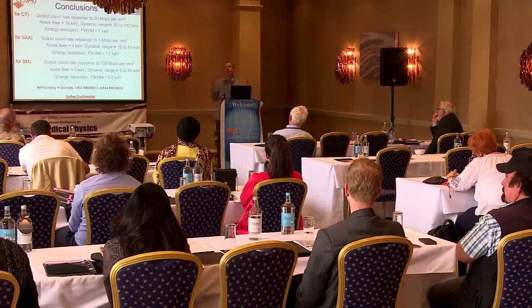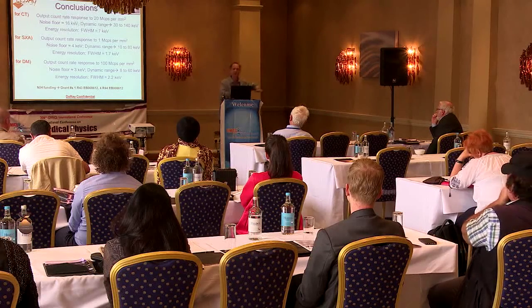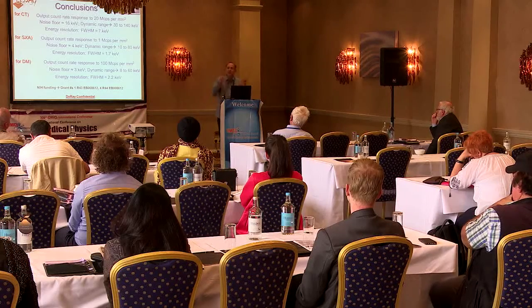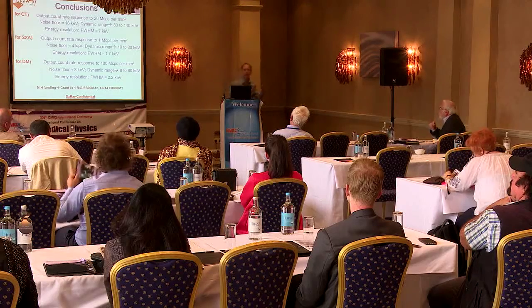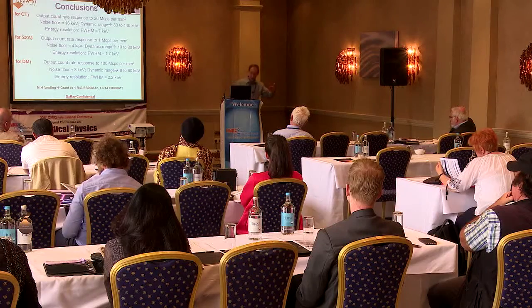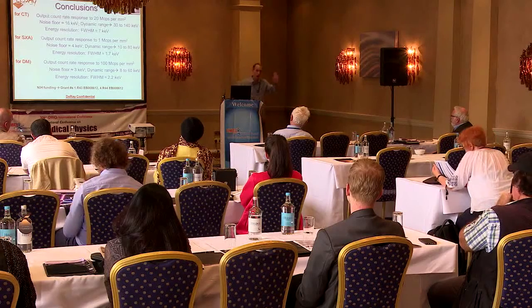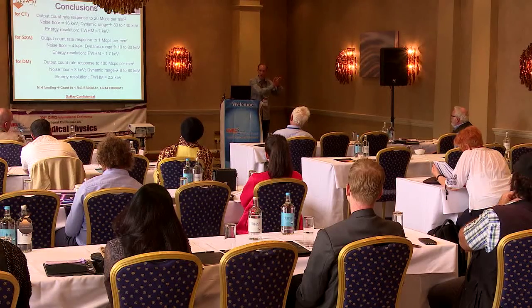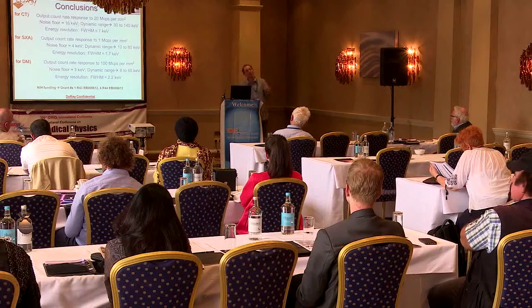We all know that in radiography, we're limited by statistical noise. And he's saying that if we take this one image where all of the X-rays are there and we break it up into 4 different images, then the statistical noise is going to be worse in each one of those images. So the images cannot be viewed alone. If they're viewed all alone, there's a lot of quantum noise in there. So the images need to be added together with an optimal energy weighting, which has a small penalty.